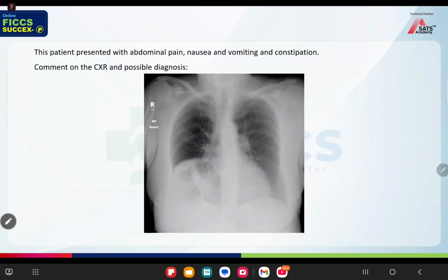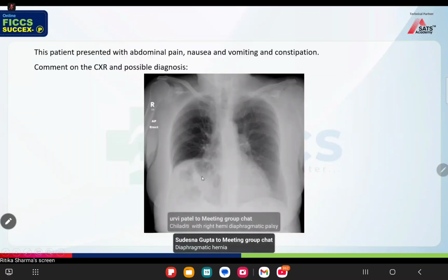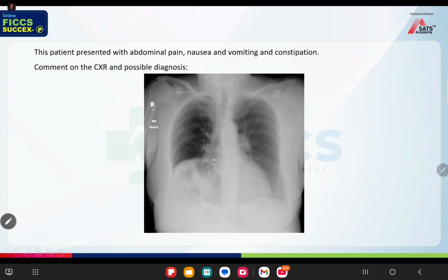So these are not bronchograms. The diaphragm is up. So if you're saying this is a bowel loop because he has somewhat features of obstruction, right? Yes. Usually do we see bowel loops this side? No, ma'am. So in what special scenario can we see bowel loops here?